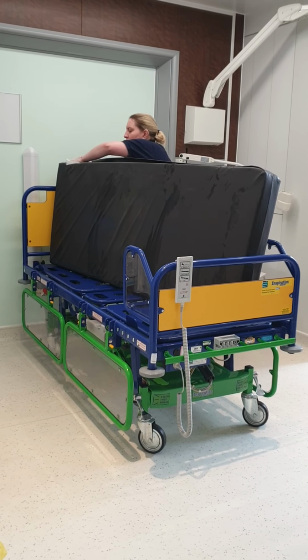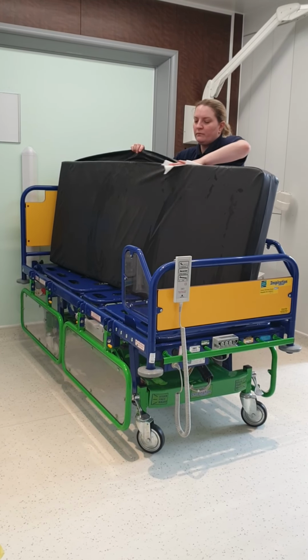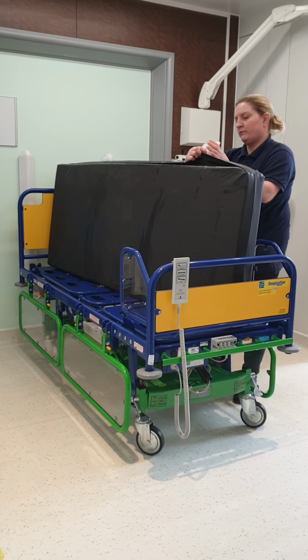As you can see, it's important to open up all areas of things like a mattress to make sure that you're cleaning within the covers where there are protective surfaces over things like zips that will also hold contamination.